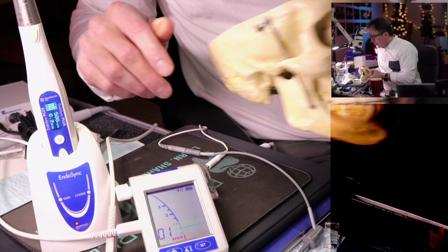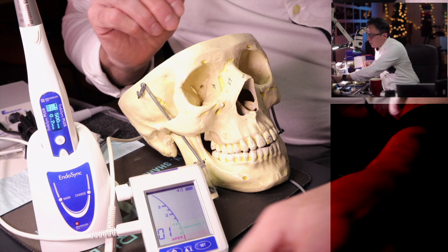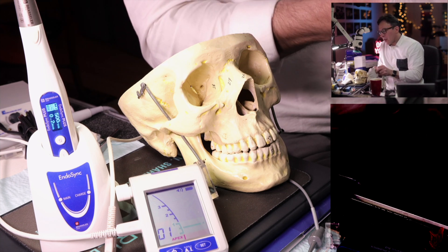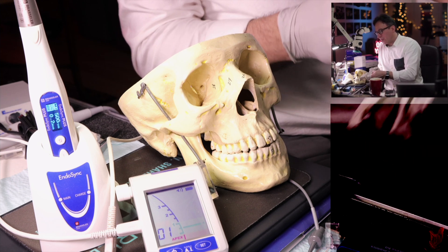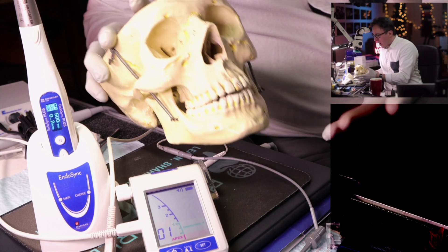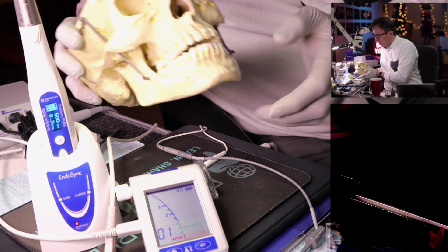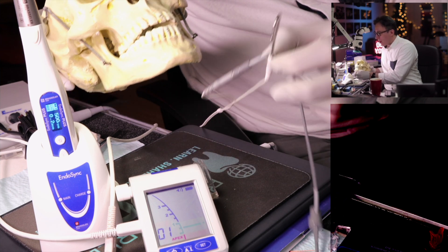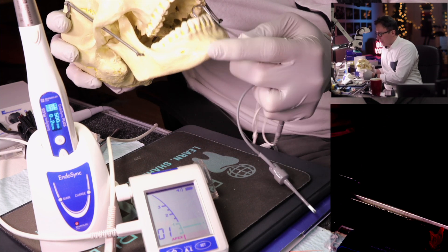Here we have Ralph, the Endosync Plus, and the Endosync AI, which is the apex locator. Let me put on my gloves for Ralph's protection. The combination of Endosync and Endosync Plus is how you do your instrumentation while keeping track of the length. The apex locator requires a lip clip, which goes on the patient's lip — in this case on Ralph's teeth.